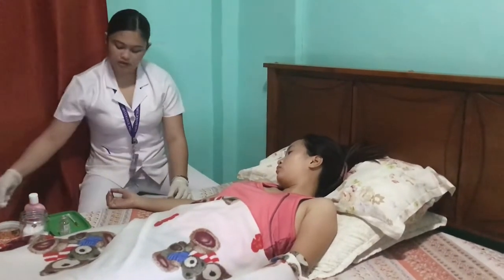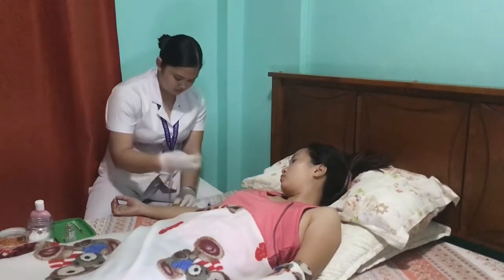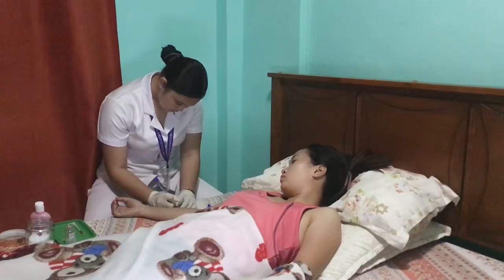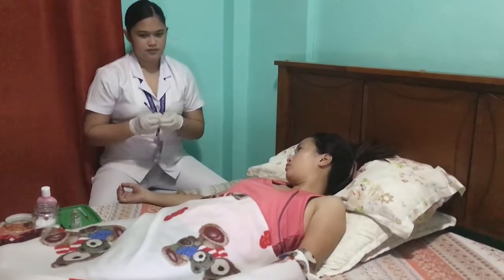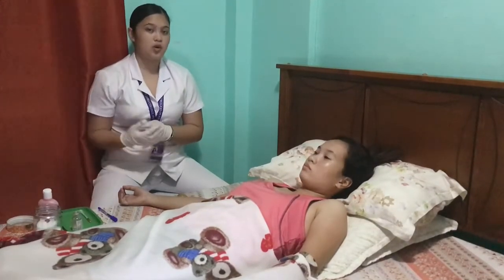Then mark it with a black or blue ballpen. Then instruct the patient to not rub the wheal or the area.